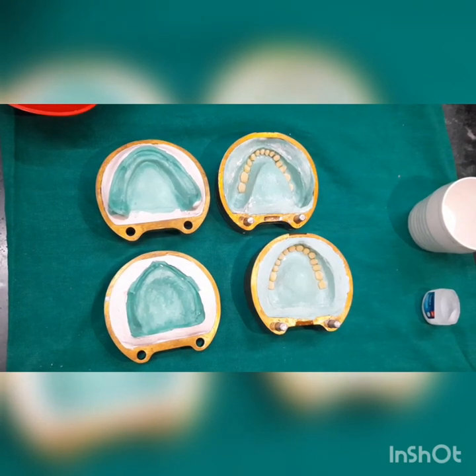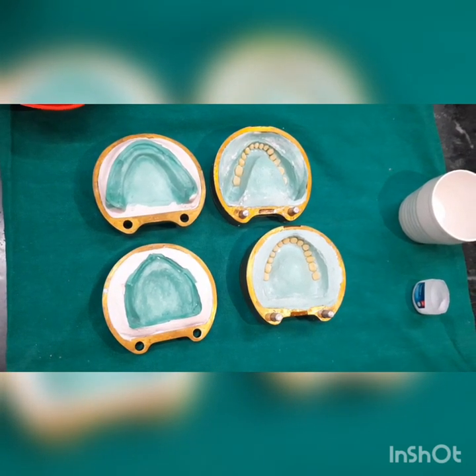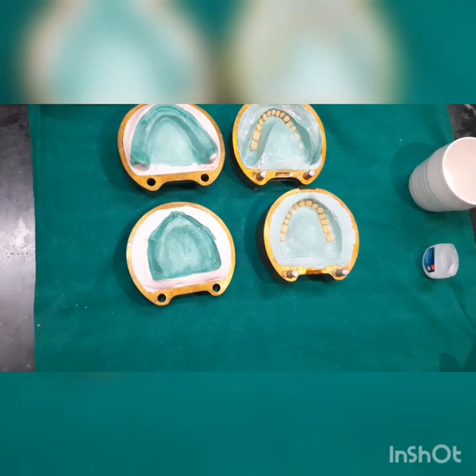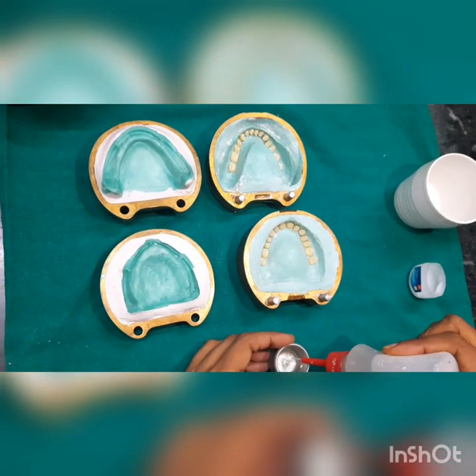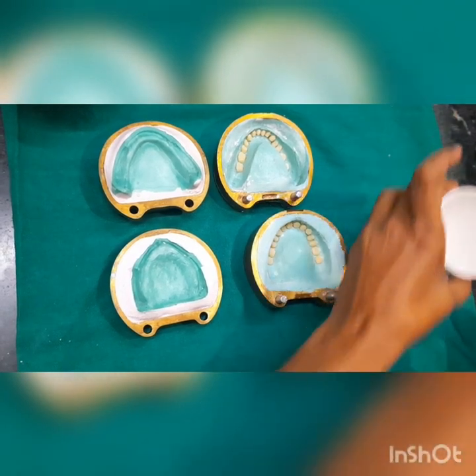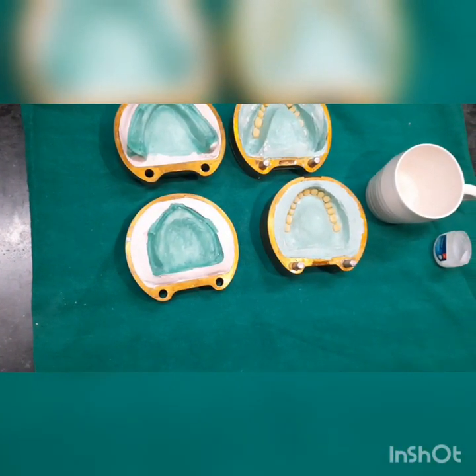First, we need to take polymer and monomer in a ratio of 3 to 1 by volume, or 2.5 to 1 by weight. Following the volume method, we will take one part liquid monomer and three parts polymer.